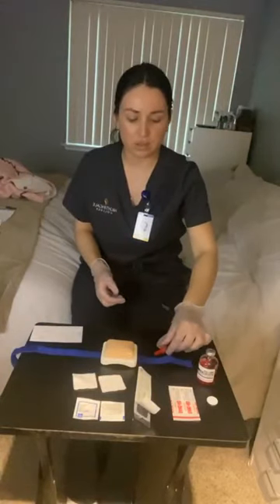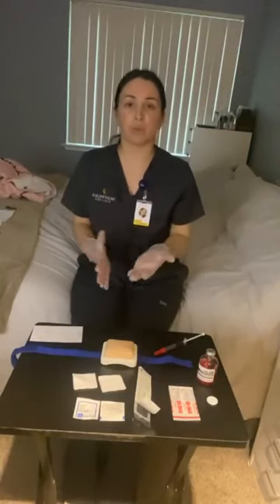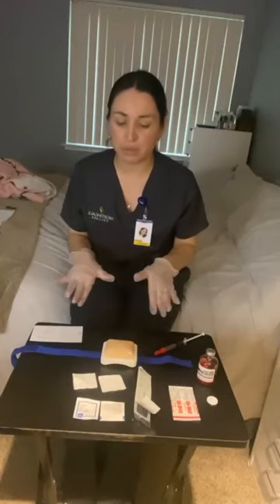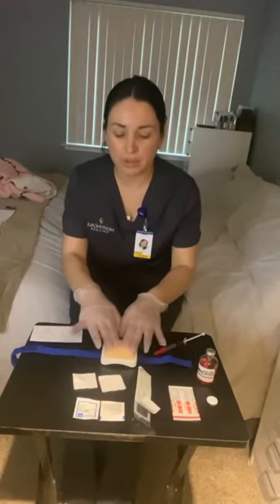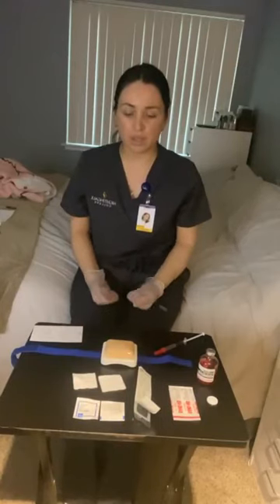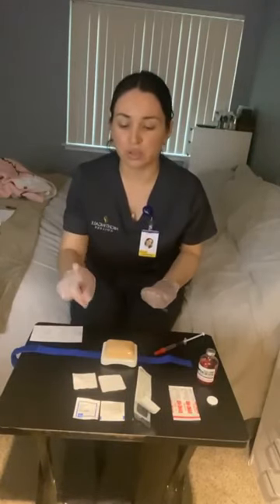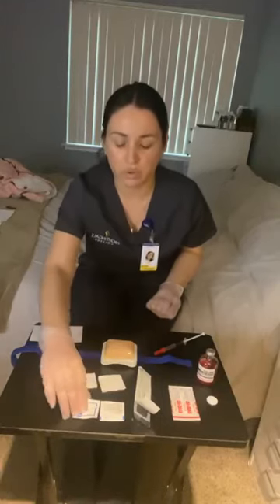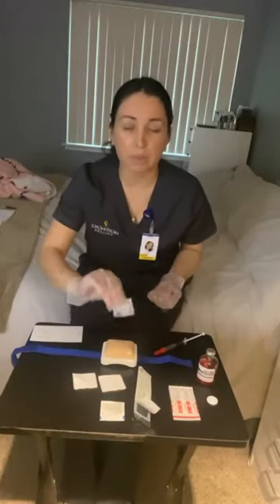Okay, next, I would select my appropriate site for a heparin injection. An ideal place would be 2 inches to the right or left of the umbilicus. I'm going to inspect the area for any bruising, inflammation, or edema. I would make sure I palpate and stay away from any masses or tenderness. Next, I'm going to grab an alcohol swab and clean it starting from the center and outward about 2 inches.